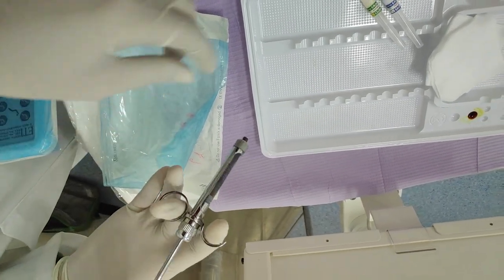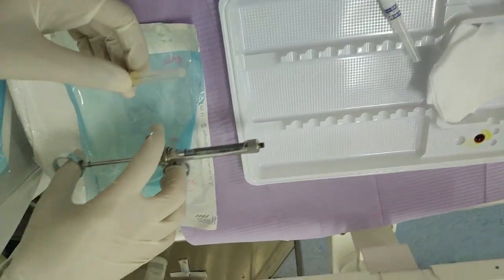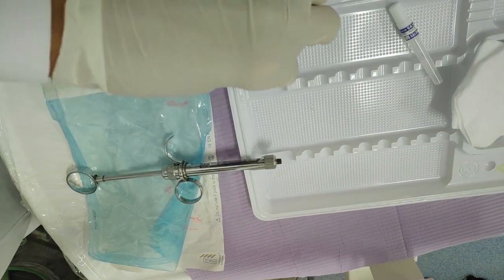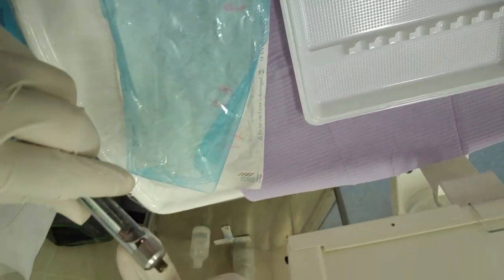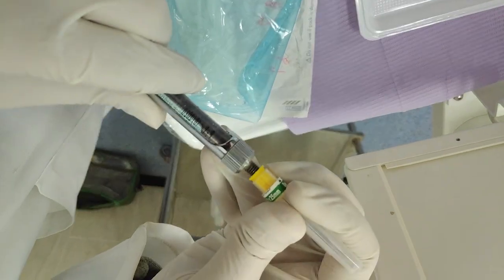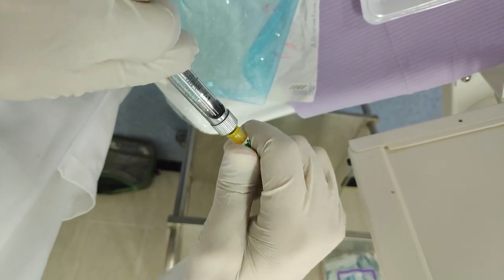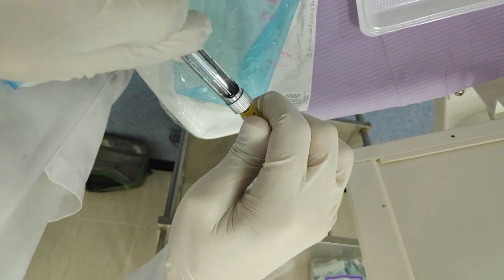Here is how we attach the needle. We should make sure the needle is not bent when we put it in so the liquid flows out properly. It's very important to know there are two types of anesthesia: with vasoconstrictor and without vasoconstrictor. Most of the time we use with vasoconstrictor.